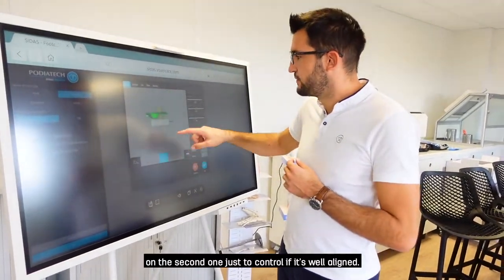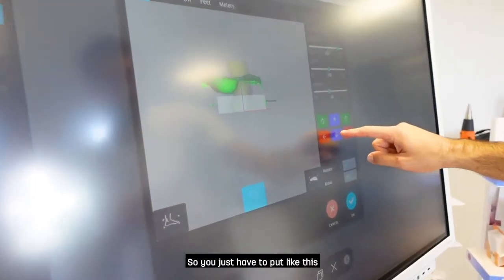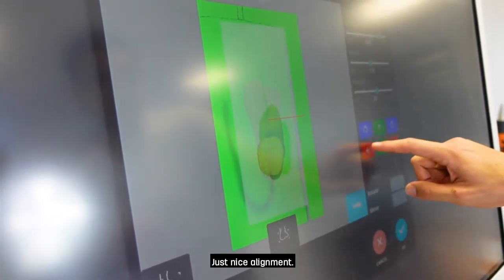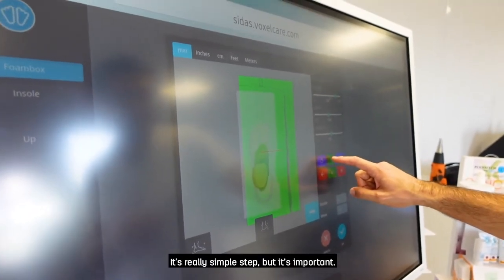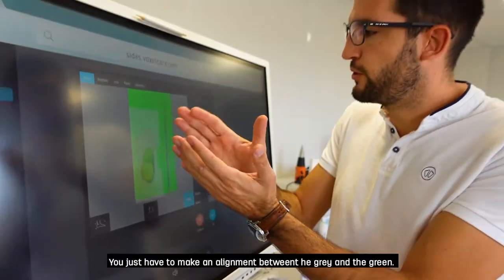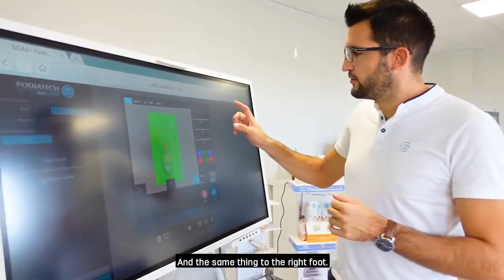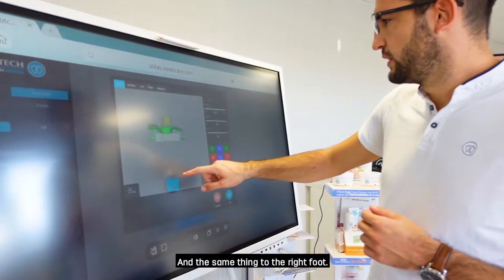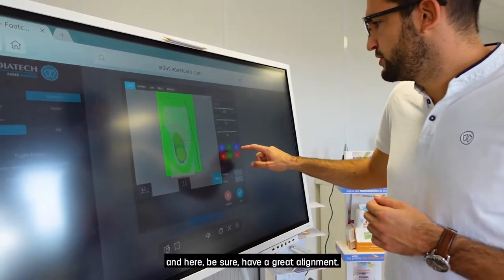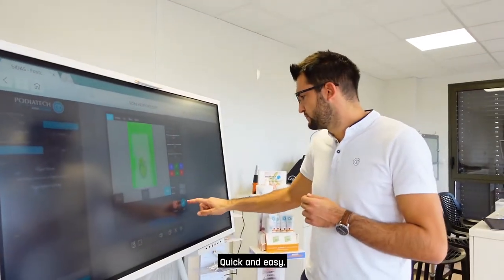You can see that the green is outside the gray, so you align them. It's a really simple but important step — you just need a nice alignment between the gray and the green, then click OK. This was the left foot first — always left first, then the right. Do the same alignment for the right foot. Make sure you have a great alignment. It's really quick and easy — in my experience it takes approximately two minutes total between scanning and completing all these steps.